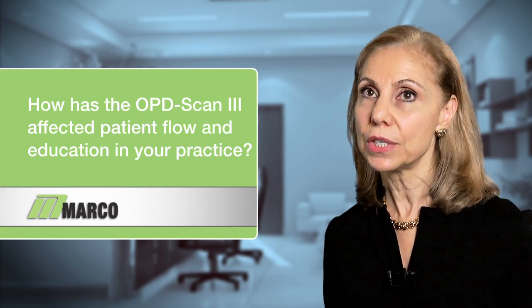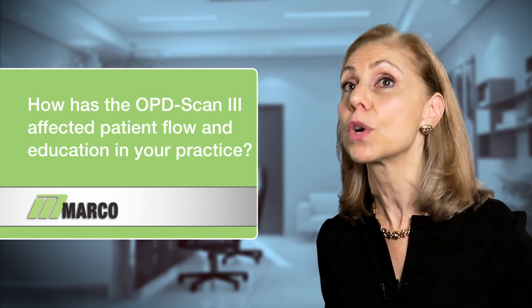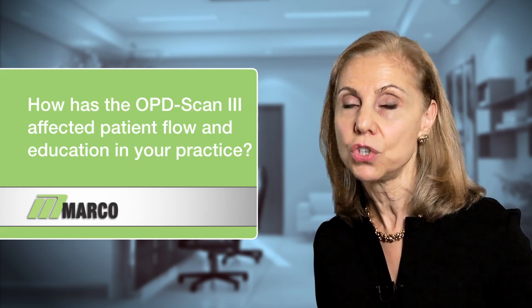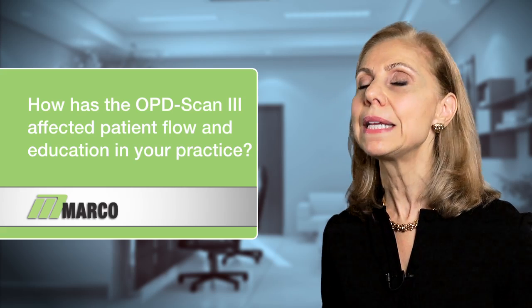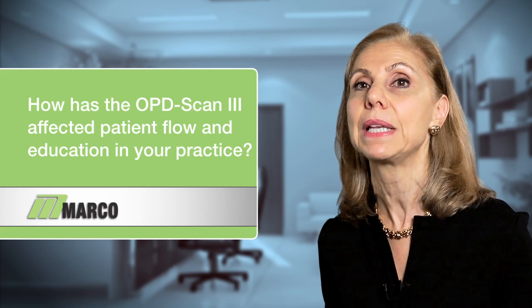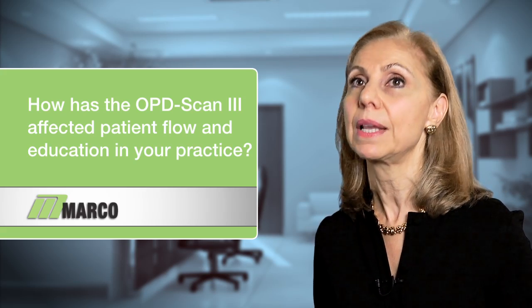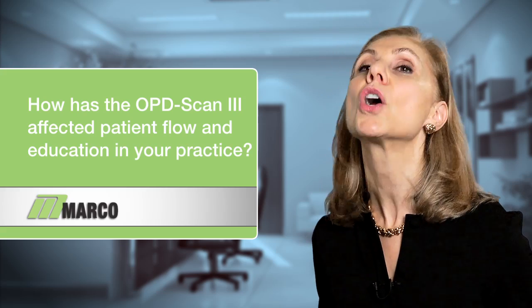And this way they understand whether they are or they are not a candidate for a specific advanced technology implant. So the OPD not only helps me, but it helps the patient and his or her family understand why they are, and equally importantly, why they are not a candidate for these available options.